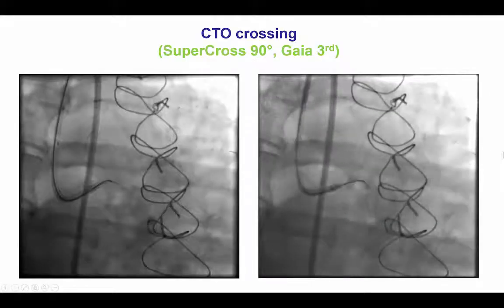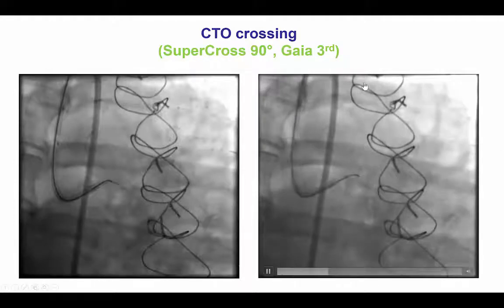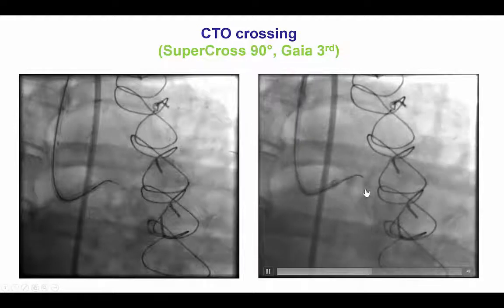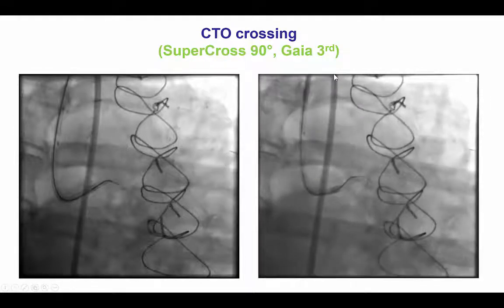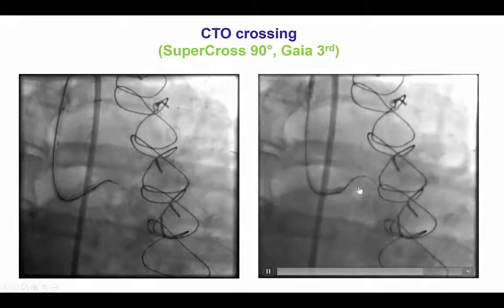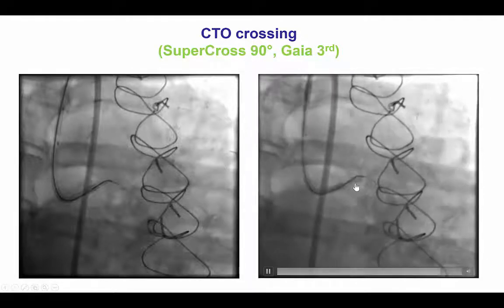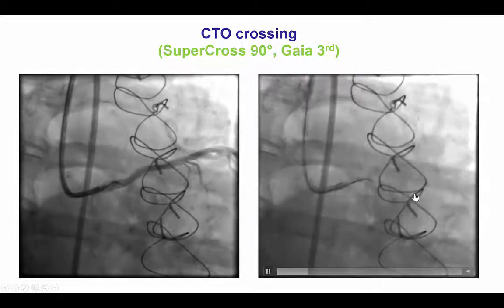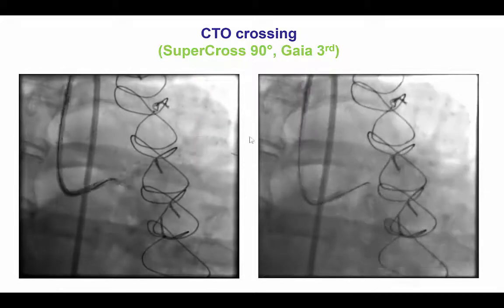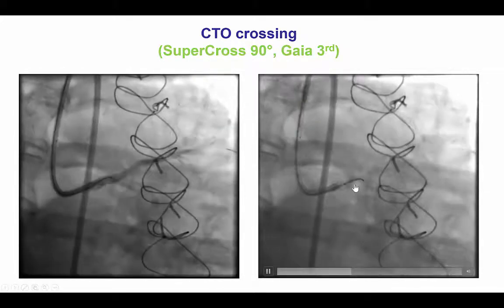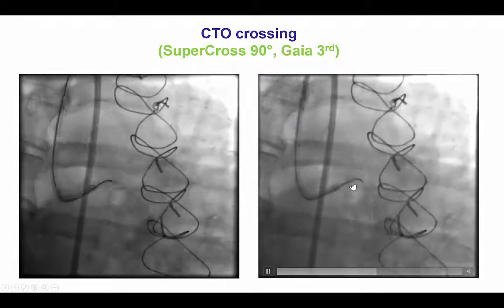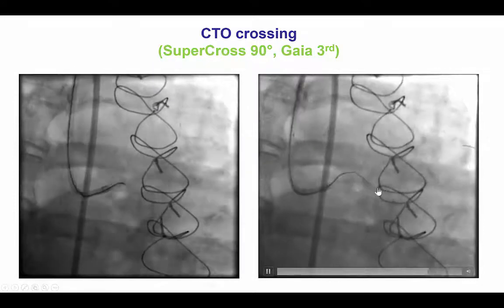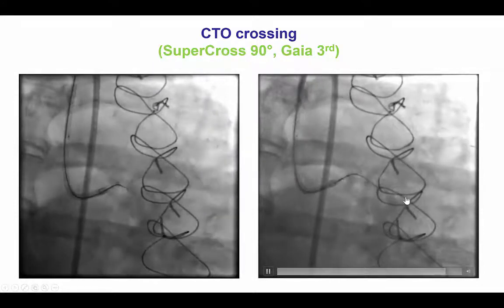In this particular case, since we did not have the Venture catheter, we decided to use a Supercross, which was advanced with a workhorse guide wire. The workhorse was removed and a Gaia third was inserted, and the Gaia third did catch through some part of the proximal cap. Upon advancement, the wire did advance along what appeared to be the course of the circumflex. One can see that once we push, there's some attempt for the microcatheter to be deformed, but eventually it keeps its shape and provides enough support for the guide wire to be advanced through the area of the occlusion.